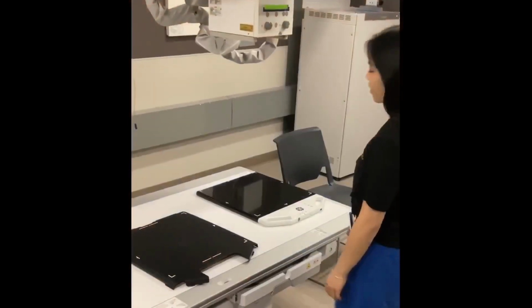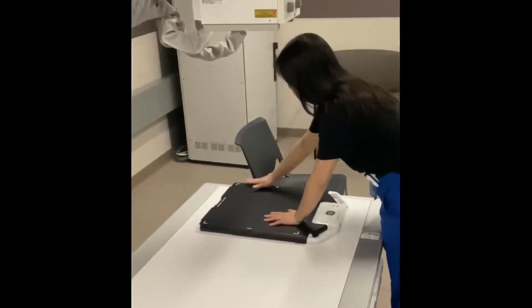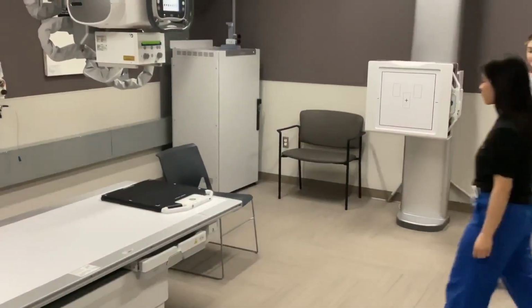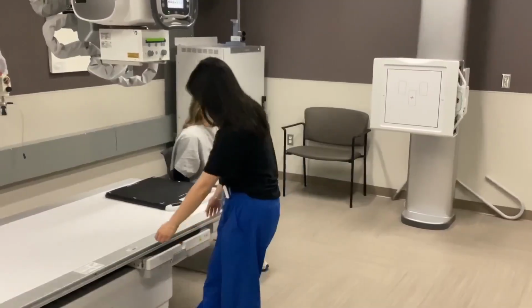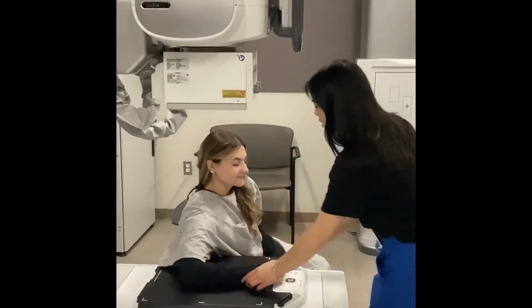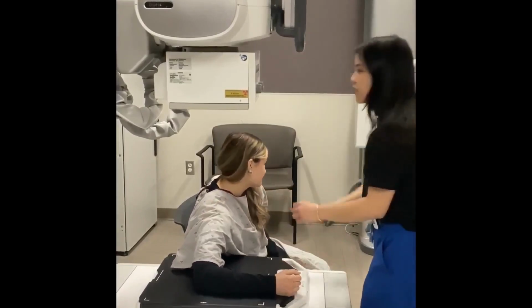A grid must be used for this projection, so we'll put that on our cassette, and we'll be using an IR size of 10 to 12 inches. The patient is seated upright with the IR placed posterior to the affected shoulder, and we'll have our patient lean slightly towards the affected side, while also tilting their head away from the affected shoulder.